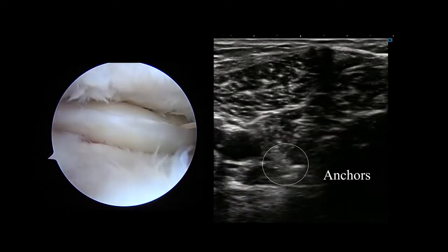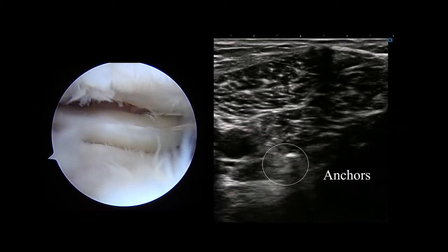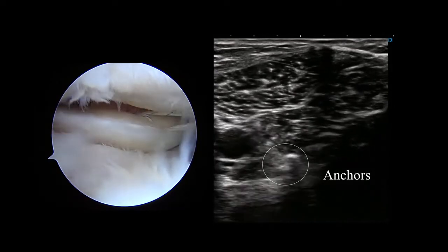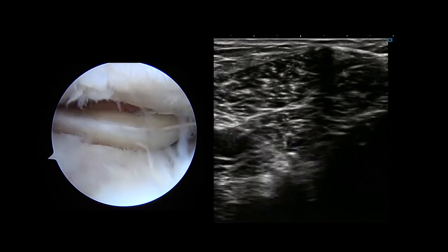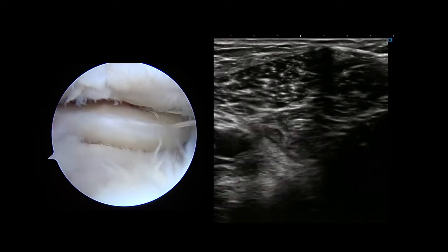After introduction of two anchors, the sutures are pulled anteriorly through the anterolateral portal and the knot is tightened. The ultrasound image shows that the two anchors are positioned on the capsule behind the posterior LM.